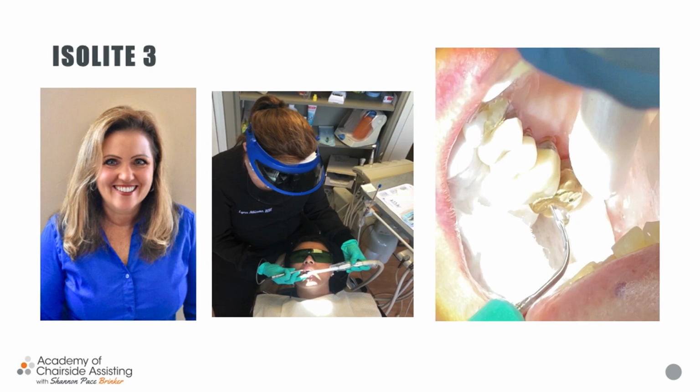But the biggest obstacle was the plug for me in an old dinosaur op, right? Because there wasn't really one close to my chair, and I had to have the cord kind of hang on the floor. For these new ops, we were a lot smarter whenever we got the new equipment, so that won't be a factor, but keep in mind where it's going to be, because it's going to need a power source, right? So that's enough for the Isolite 3, okay?